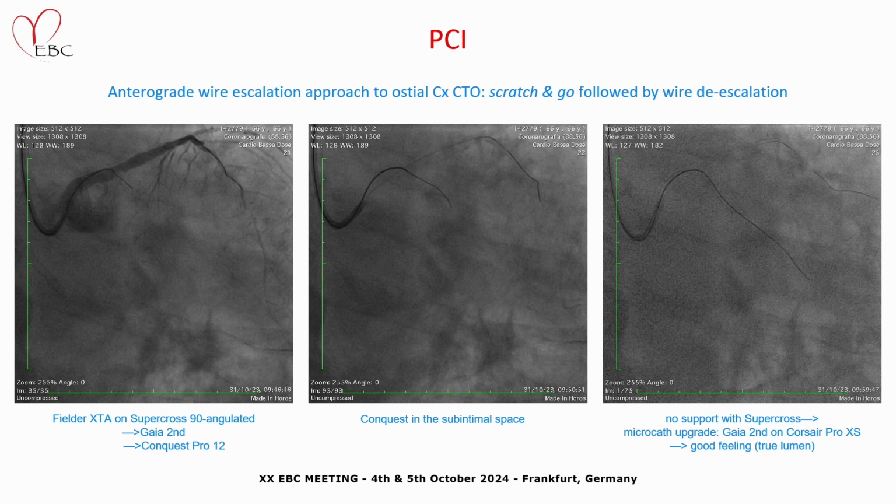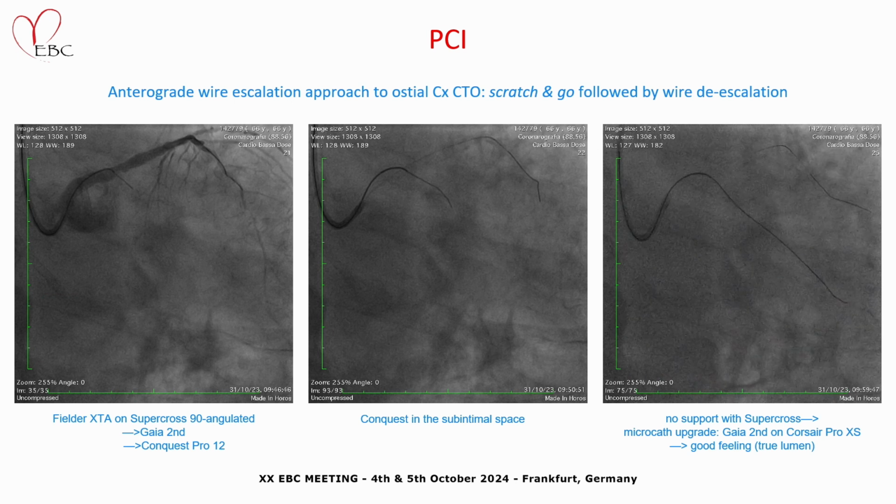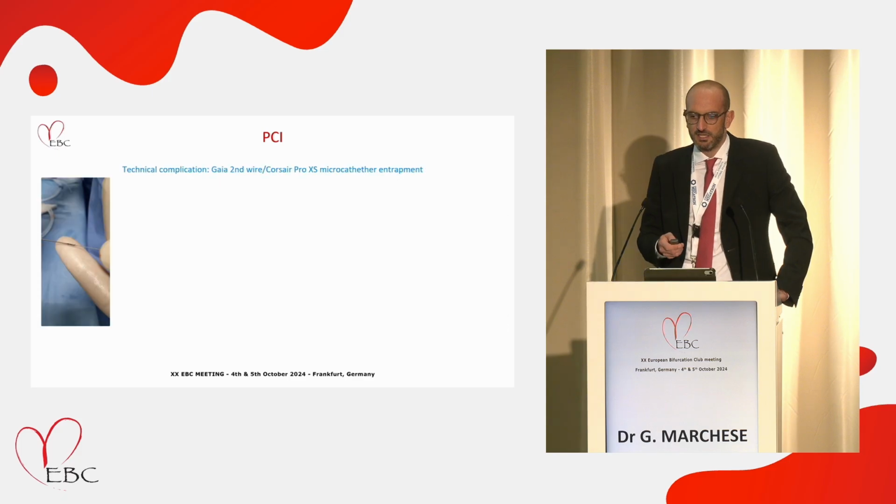And with this strategy, we were able to reach the distal true lumen. This is the imaging angio feeling, but it was a good feeling also from the tactile. So at this point, we have a technical complication.